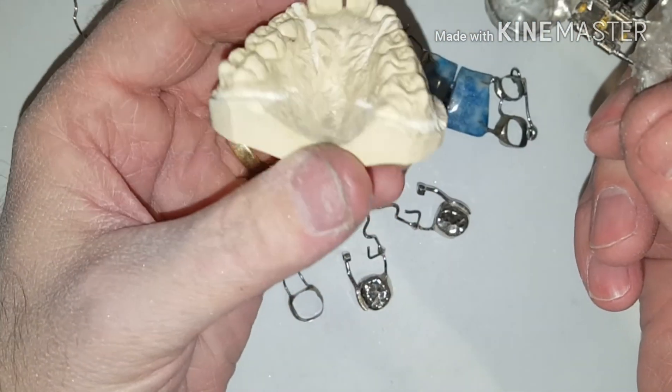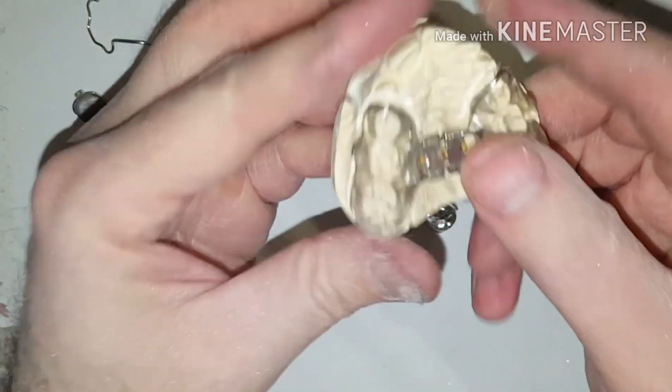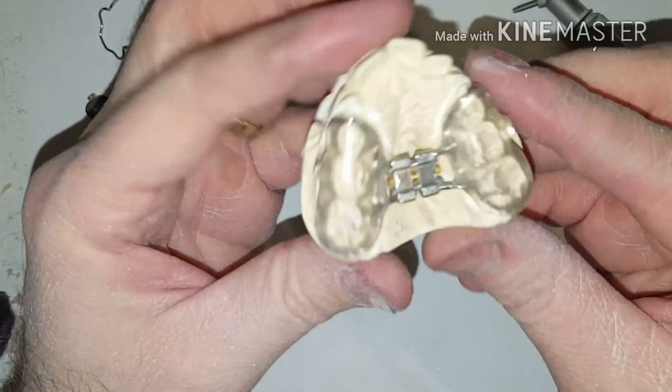This bonded expander had a very low depth, so I definitely want to add some micro-etching to it to allow the glue to stick better.